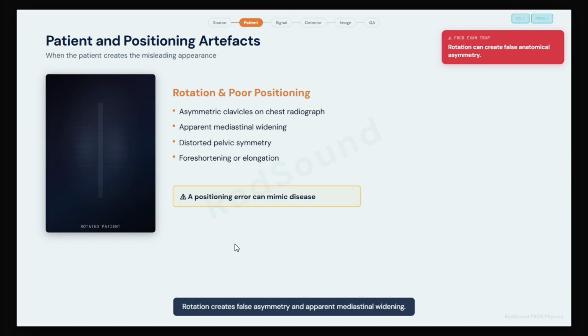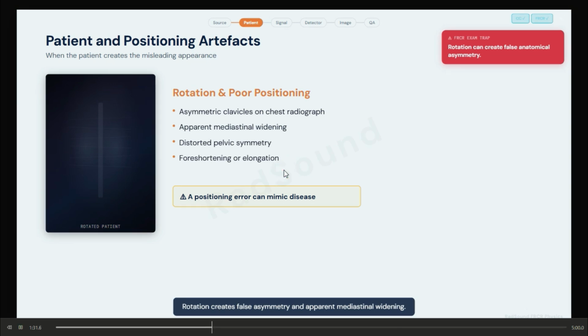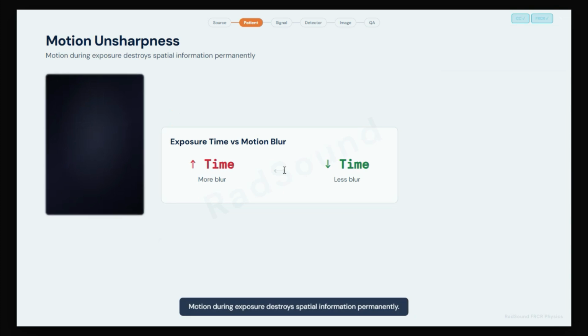Take a proper inspiration, for instance, just say what you would say in an X-ray. Taking proper inspiration, the patient should not move and should hold their breath. So proper communication can minimize such artifacts, and so can proper positioning. Still inside the patient, we may get errors or artifacts because of abnormal position, abnormal movement, or external objects on the patient. Sometimes there is patient movement, as I mentioned: respiratory, cardiac, and others.